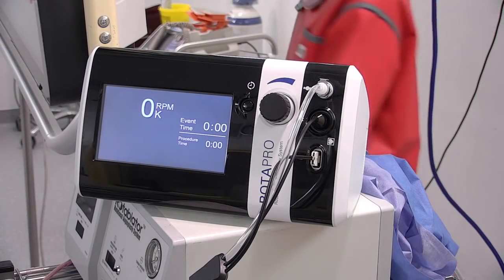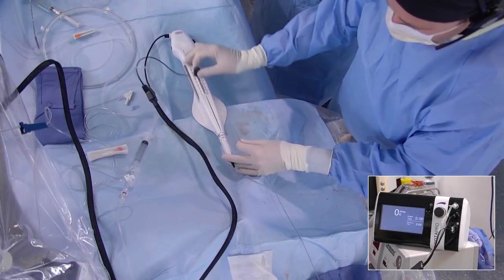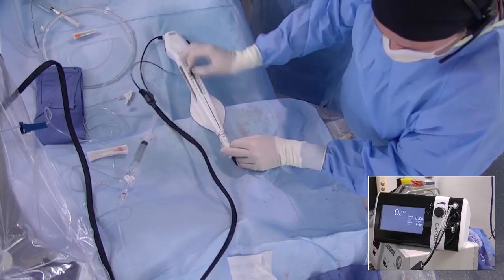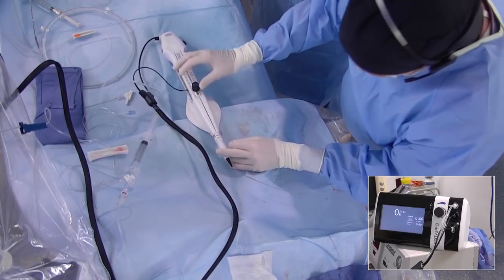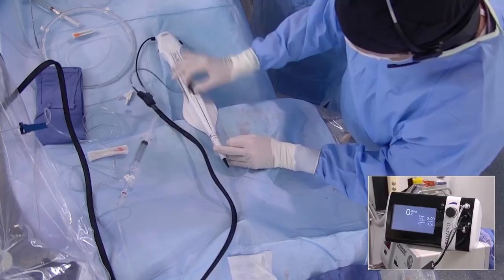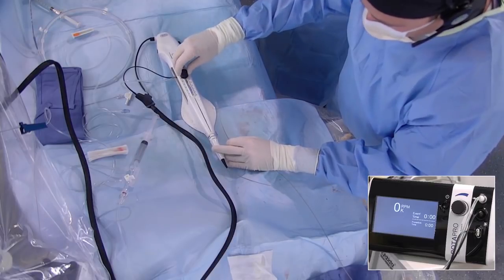So first I will remove the bubbles of air, because sometimes it can induce, I think, distal embolization, and maybe you can see that there are a lot of small bubbles. So usually I do this to be sure. I think it can induce slow flow, especially if there is a lot of air inside the device. I think it's okay now.